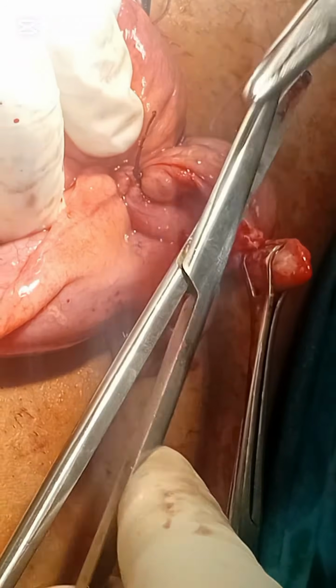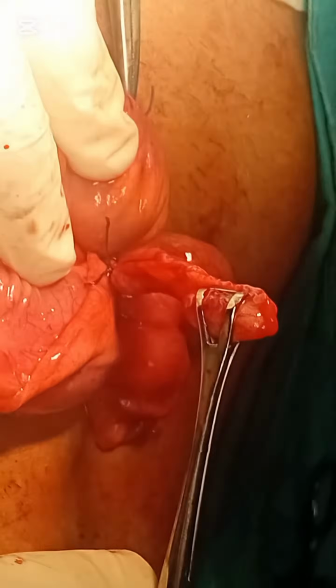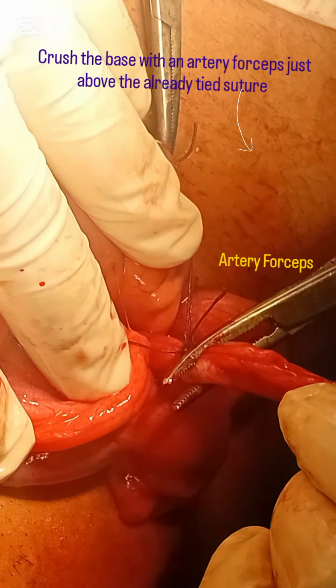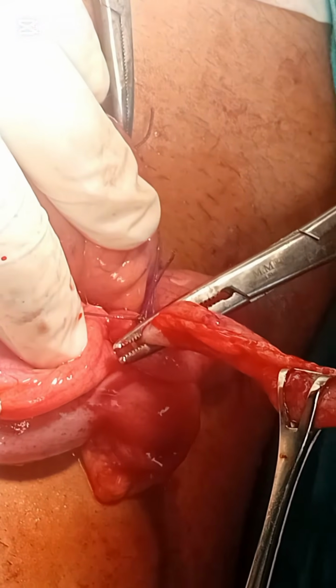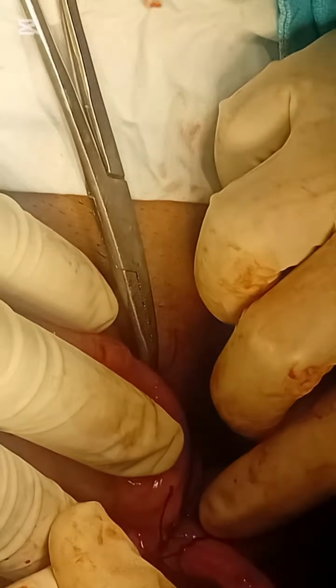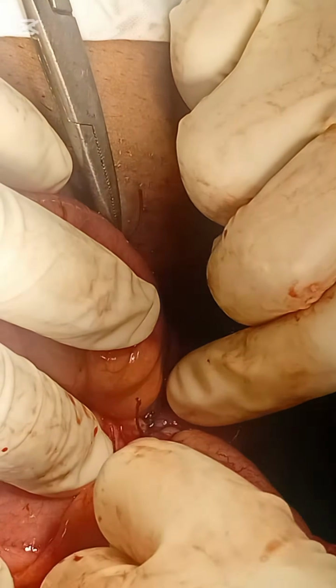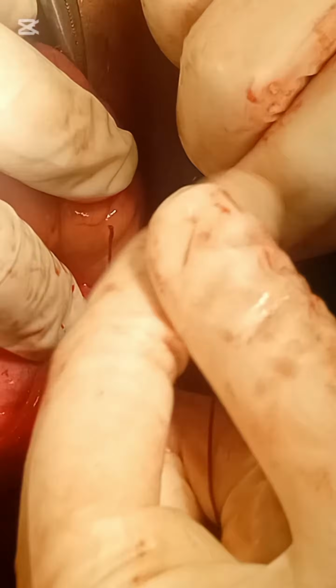We have ligated the base of the appendix. Now we will crush the base with an artery forceps just above the suture. Hold it for 5 to 10 seconds. Now tie another suture at the base where we have crushed with artery forceps. The knots shall be 5 to 6 and tightly firmed.